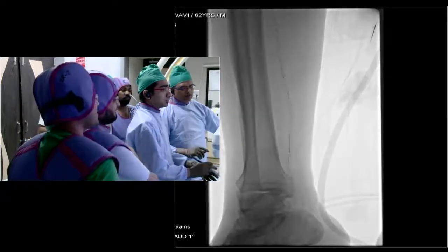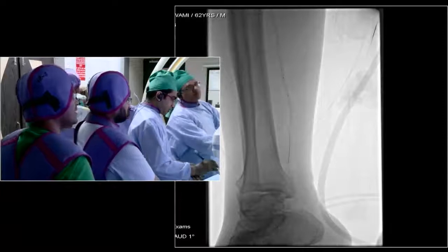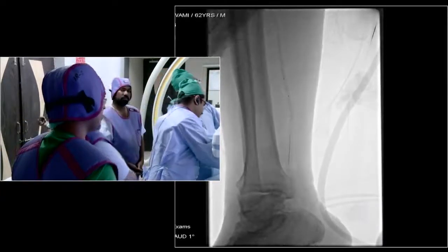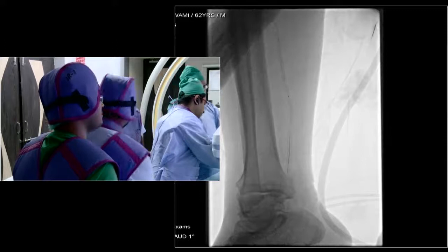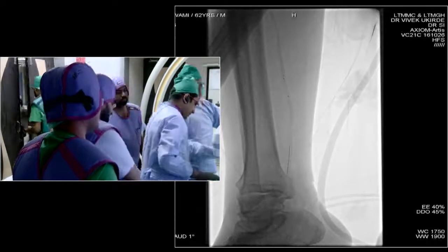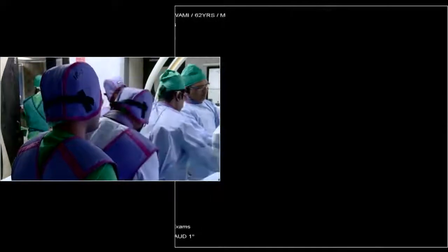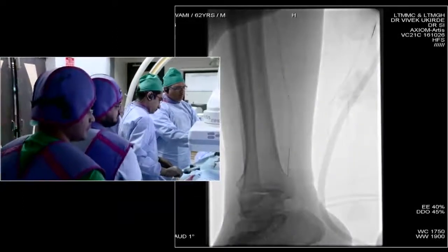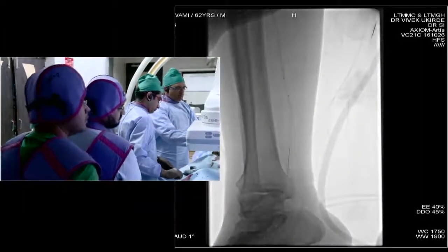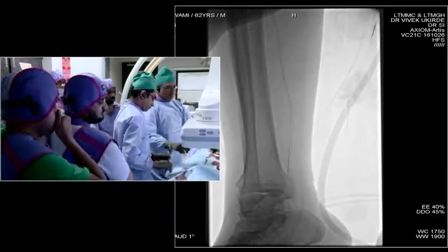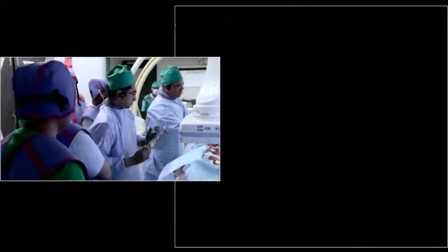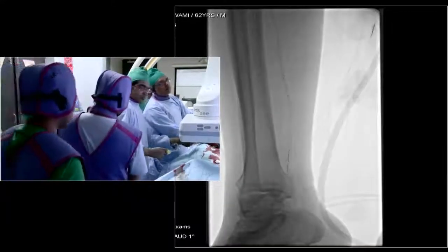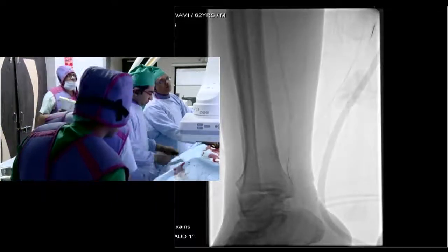We are deflating, putting it on negative, and pulling out. The scaffold goes through a four French introducer very conveniently without any problem, though in this case since it is a crossover sheath, a six French sheath has been used.